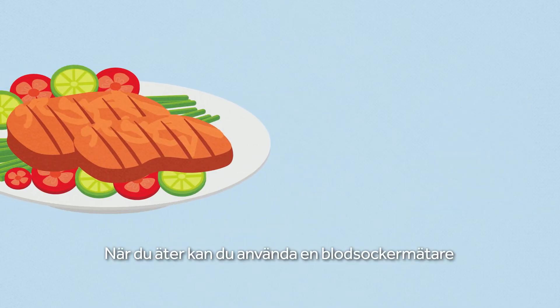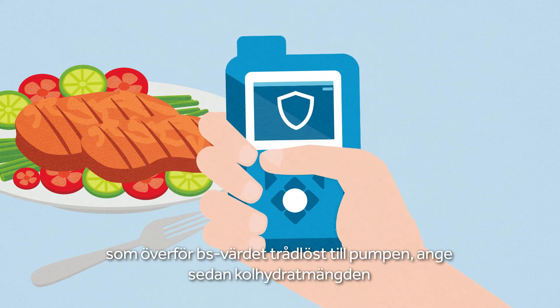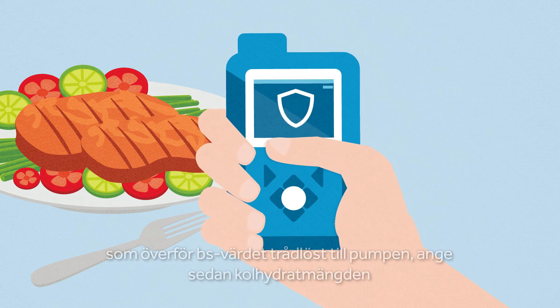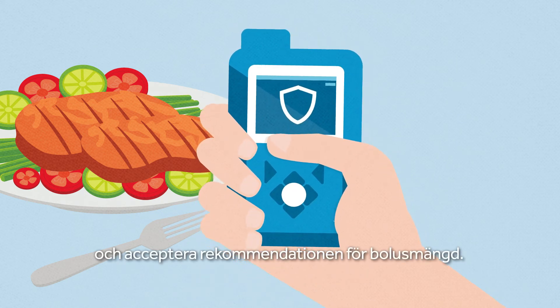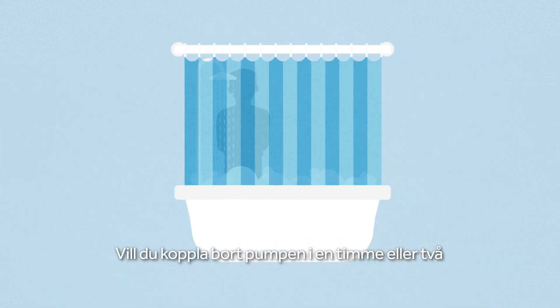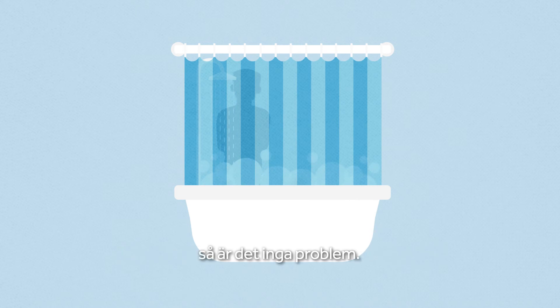For meals, simply use a blood glucose meter to check your blood glucose levels. Enter the carb count into the pump and accept bolus dose recommendations as calculated by the insulin pump system. And if you want to disconnect the pump for an hour or two, you can do so without any problems.